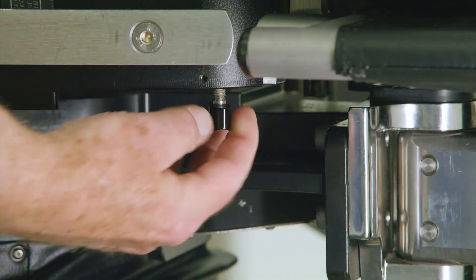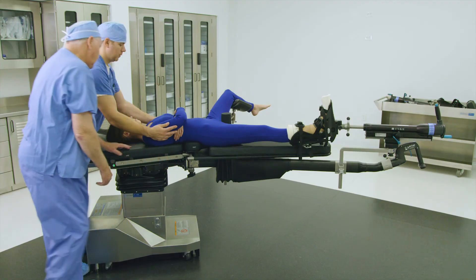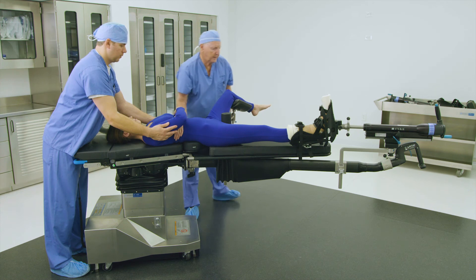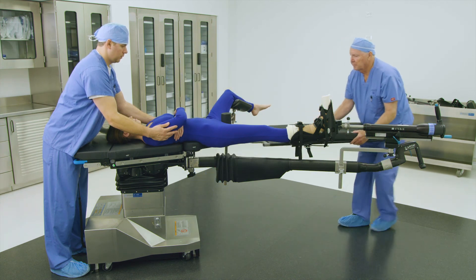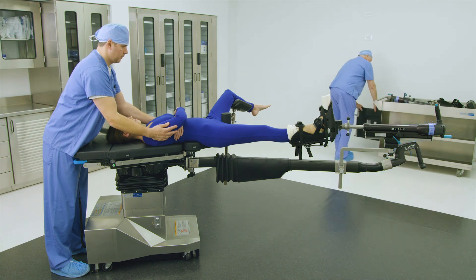Unlock the two knobs under the left and right side of the patient transfer board's prongs, found right above the abductor spar rosettes as shown here. Remove the patient transfer board and return to storage.